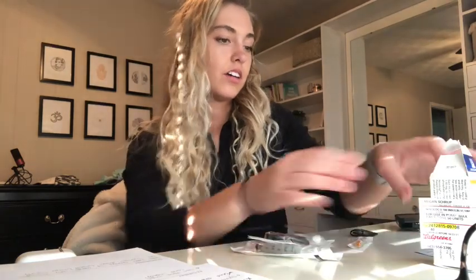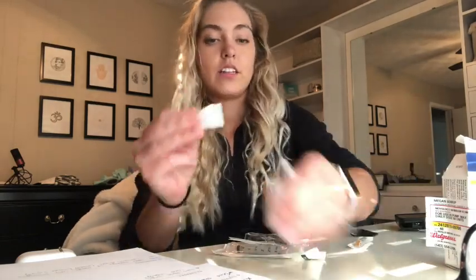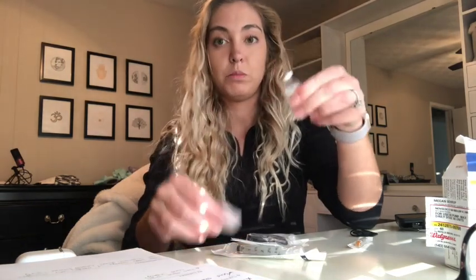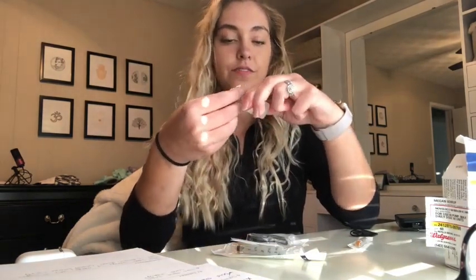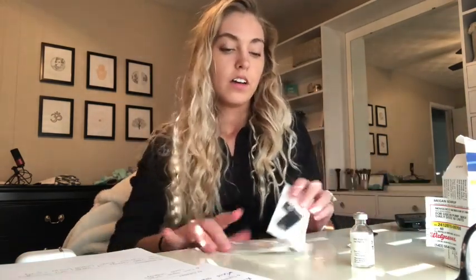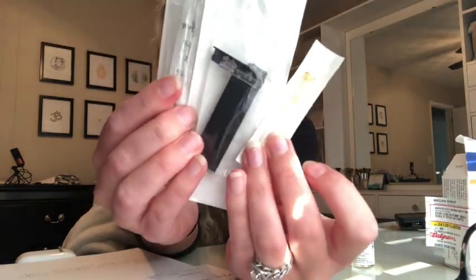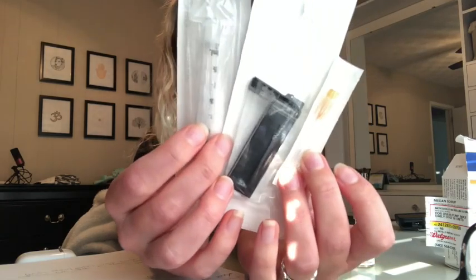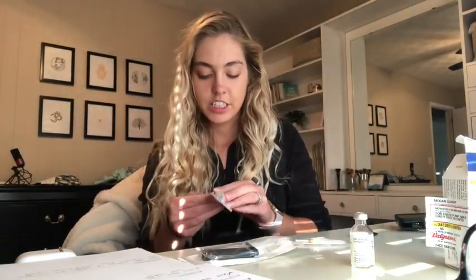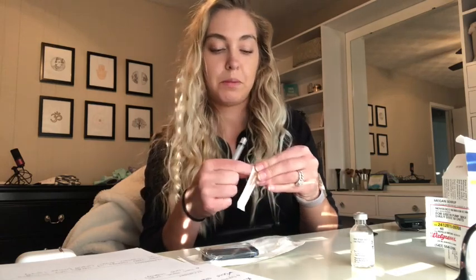Okay, so the first thing I'm gonna do is grab my insulin and clean the top off with some alcohol. Just like that. Just to make sure it's disinfected with an alcohol wipe. So these are the three things that come with the pump for how you refill the cartridge. So this is a syringe. So I'm just gonna take the syringe out of its packaging and then you twist the needle tip on.